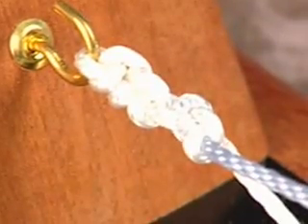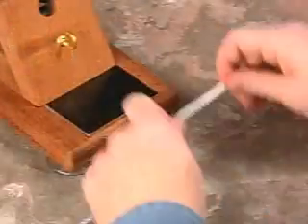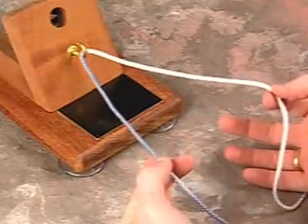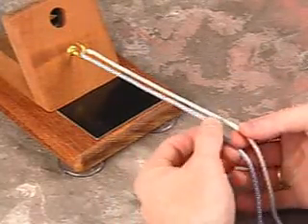This is a demonstration of the Revo knot. As with all non-sliding knots, you do not have to have the post limb half the length of the loop limb.